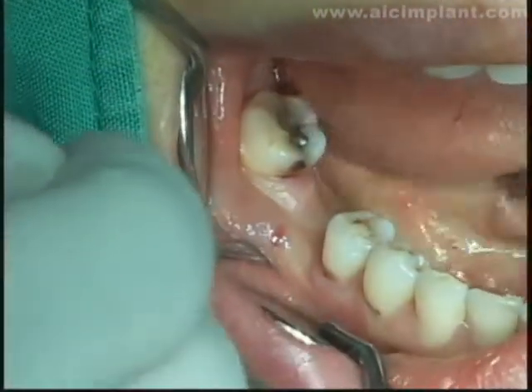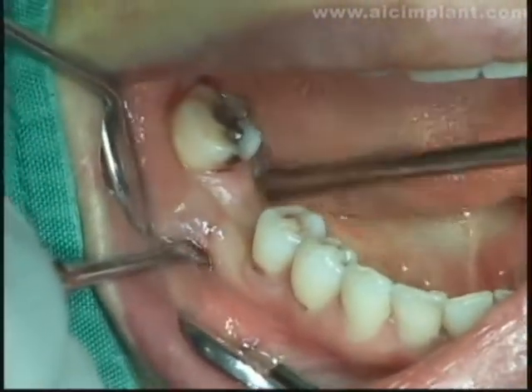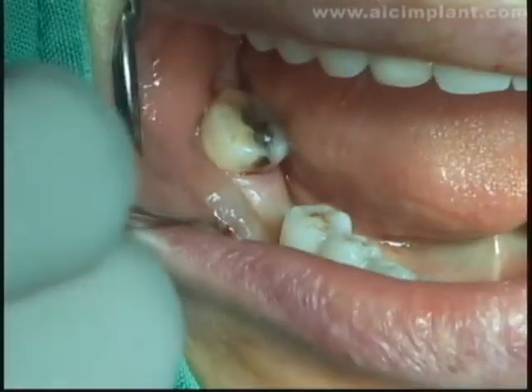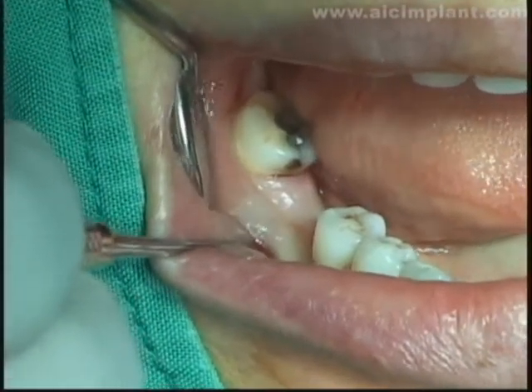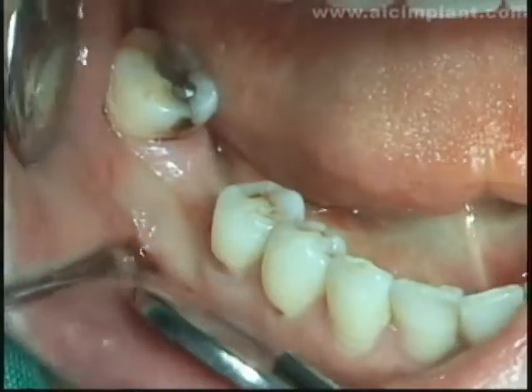The mucogingival junction is approximately here. The amount of attached gingiva has more margins. We can try flapless surgery under these conditions, but the gingiva on the buccal side is insufficient. Thus, we shall go with the conventional method.